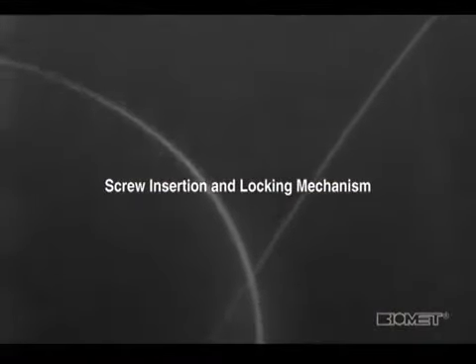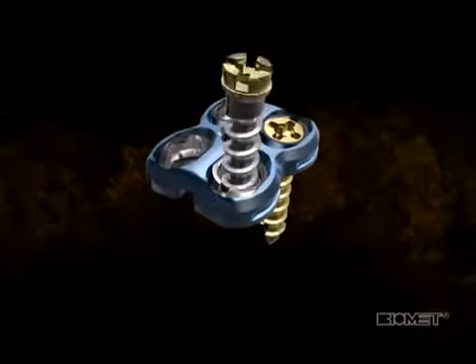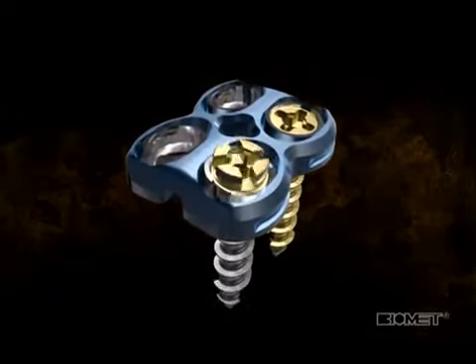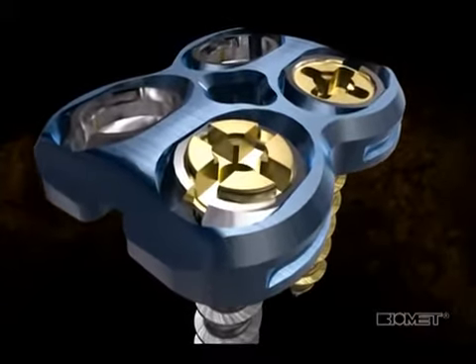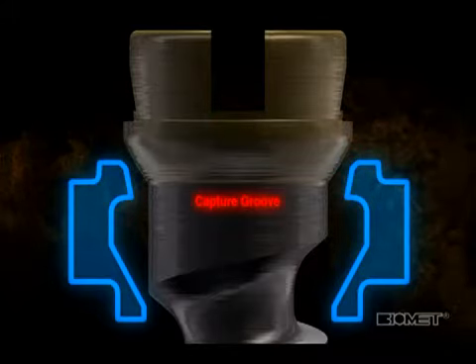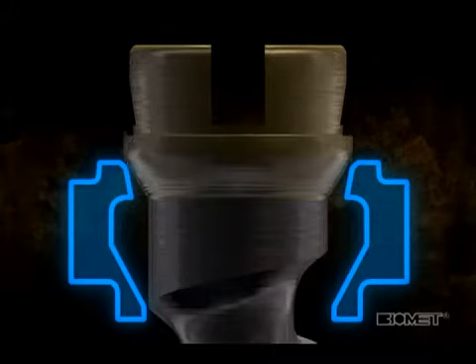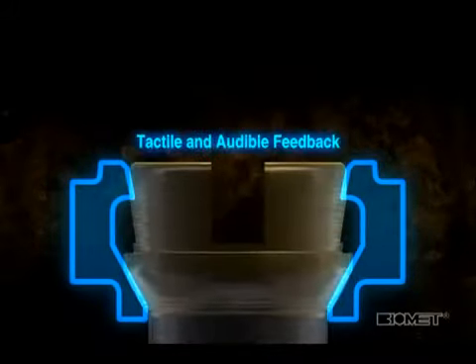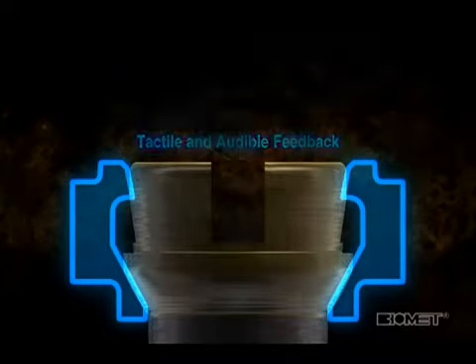Screw insertion and locking mechanism. The MaxAn system utilizes a ring locking mechanism in the plate that captures the screw by closing around the sides of the screw head. The head of the MaxAn screws has a locking lip which interacts with a corresponding capture groove inside the ring. When the locking lip snaps into the capture groove in the ring, the screws are captured to the plate. There is tactile and audible feedback that this capture has been achieved.